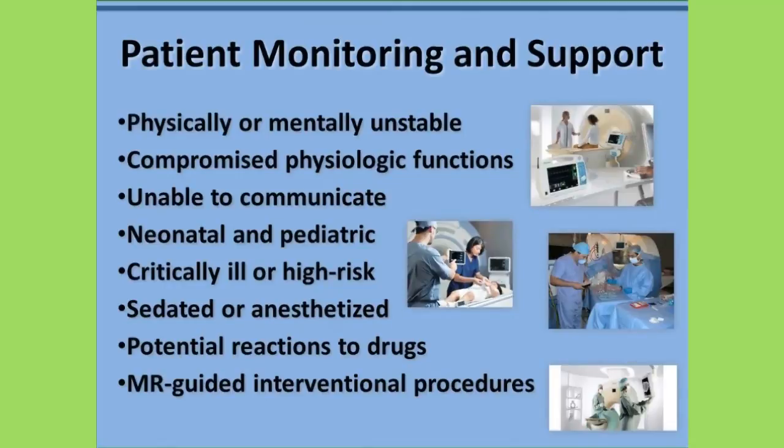Another important safety topic that I'd like to cover is patient monitoring in the MRI setting. Monitoring is indicated for a variety of reasons, including for patients who are physically or mentally unstable, for critically ill or high-risk patients, for patients who are sedated or anesthetized, and of course for patients who are undergoing MRI-guided procedures or interventions.